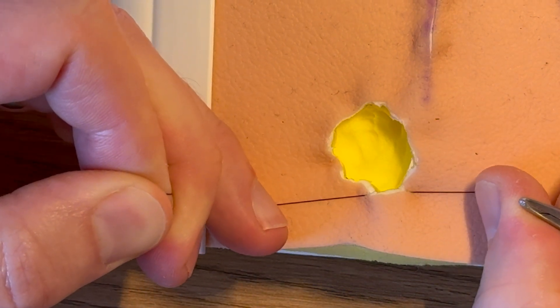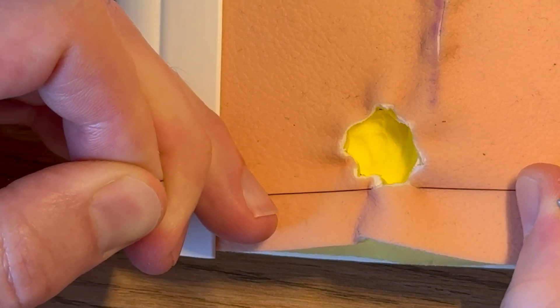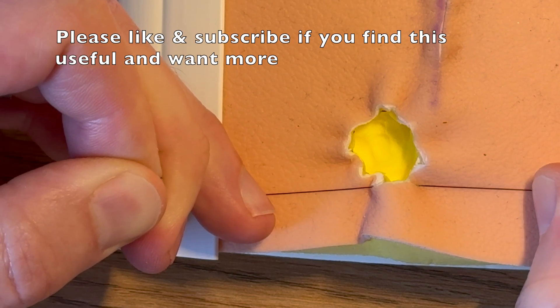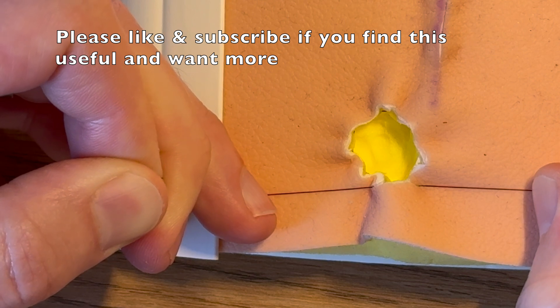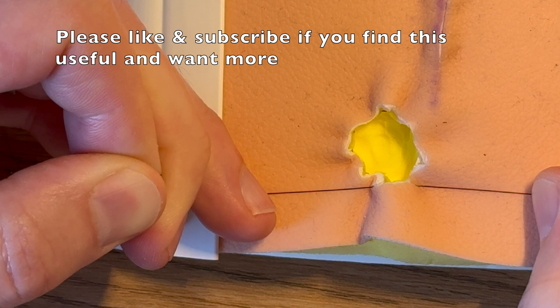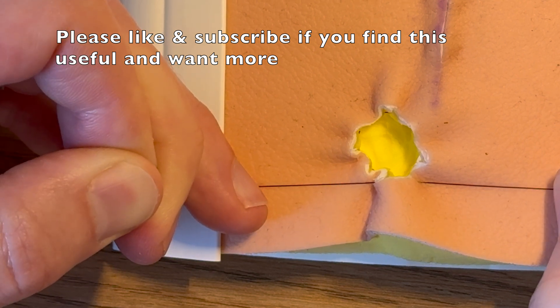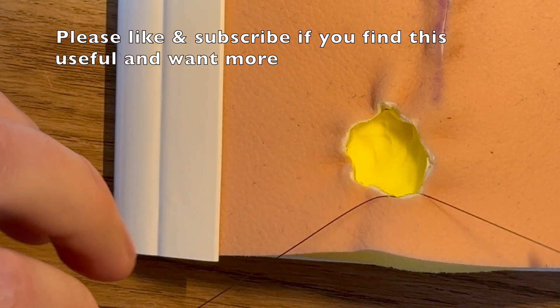We expect it to close down to maybe about 50 percent of what it was. When you get to about there you're starting to think I could pull it a bit more, but what will happen is that the stitch will break.